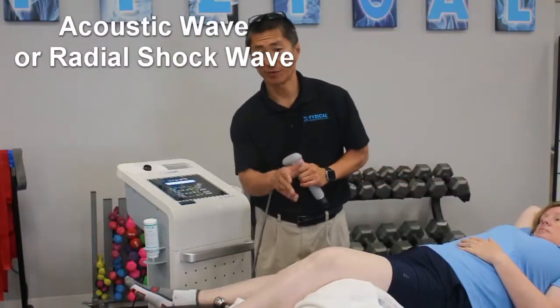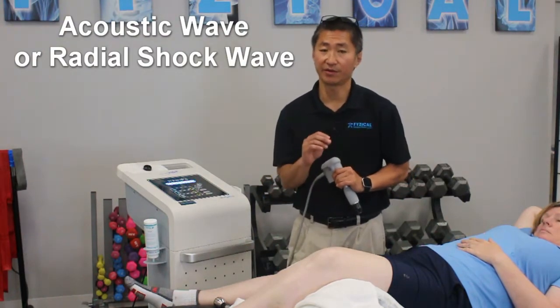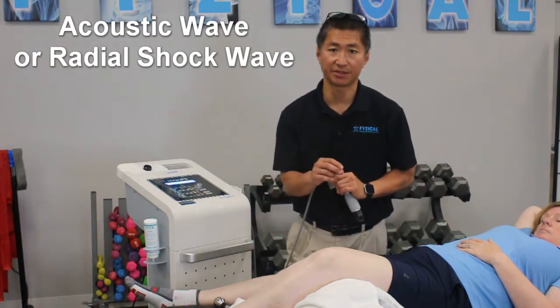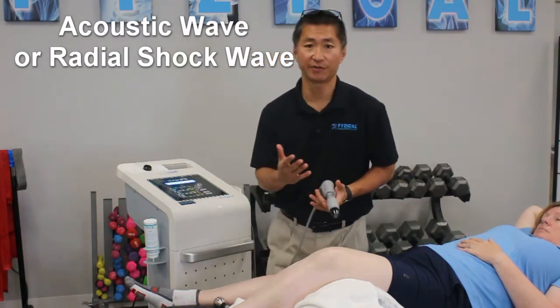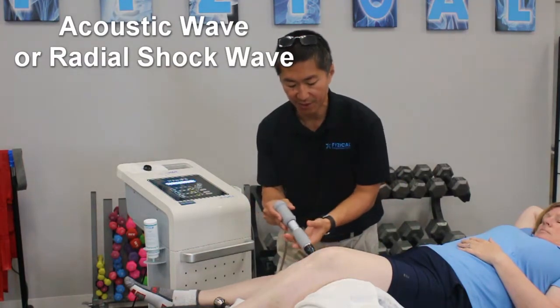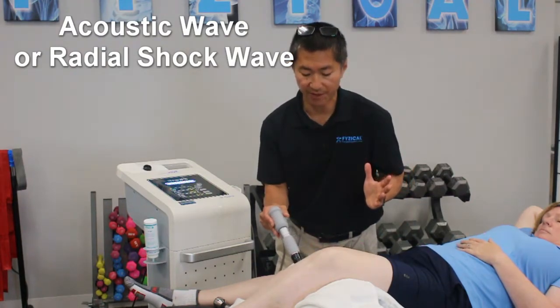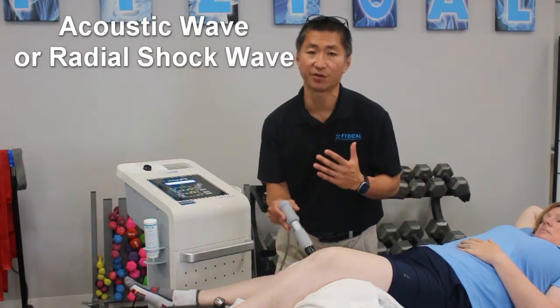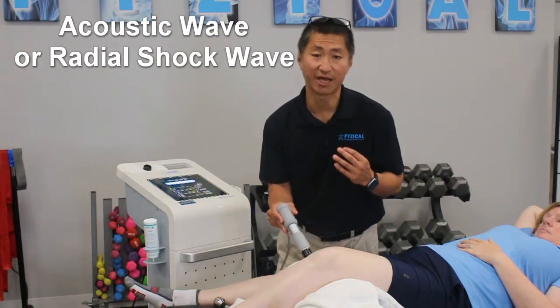Okay, so now that we've looked after the fascia, hopefully the fascia is going to be nice and loose. We're going to get in there on the actual ligament and the muscle itself to try and sort of encourage the healing process. One of the tools that we use a lot here is called the Miracle Wave. What it is, is an acoustic wave, otherwise known as a Radial Shock Wave as well. And they found that when it gets onto a tendon, it can really help speed up the healing process, break down any scar tissue, and just allow it to heal faster.